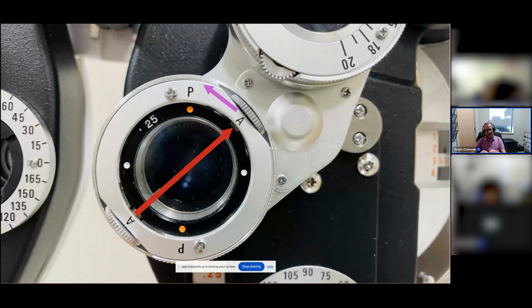In a plus cylinder phoropter, you're going to go the opposite way. You come out with the same result optically, but the numbers will seem different, but you actually get the same lens power. But because we use minus cylinder, plus cylinder, you have to use the method that corresponds with your phoropter.